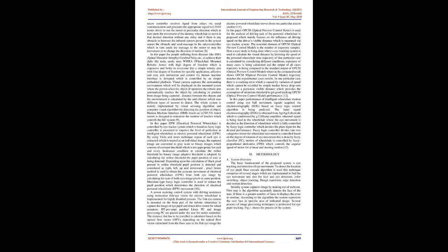In this paper, assistance for neuromotor disabled persons is eliminated by implementing a novel technique for an eye-controlled wheelchair, which is a more independent and cost-effective system than the traditional electrical wheelchair. Here the experimental setup is made where a webcam is mounted in front of the patient to capture the image of one of the eyes, which is highly precise for tracking the position of the pupil, where an image processing technique is implemented for determination of accurate pupil position.